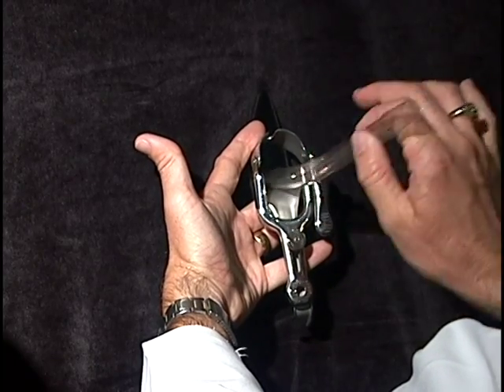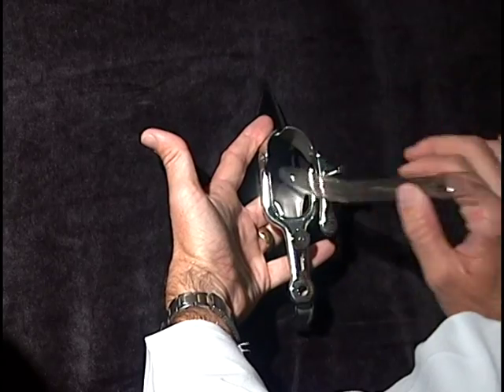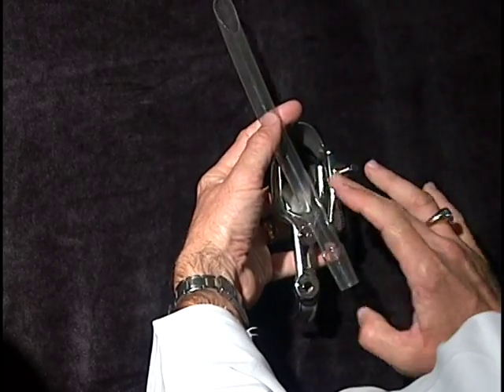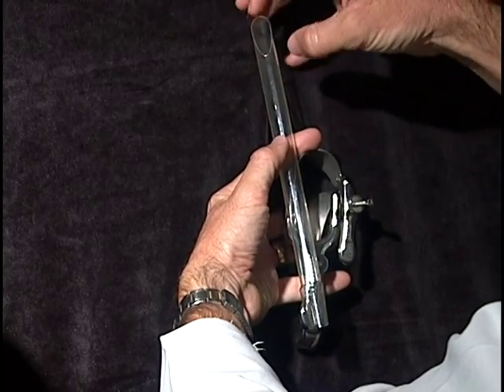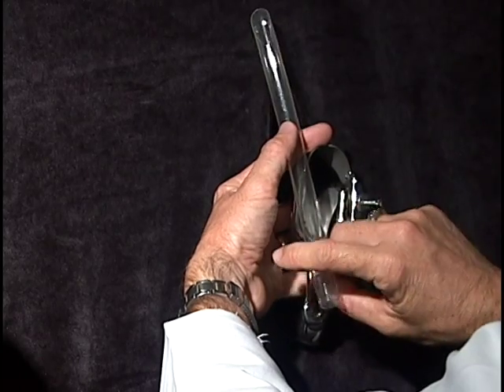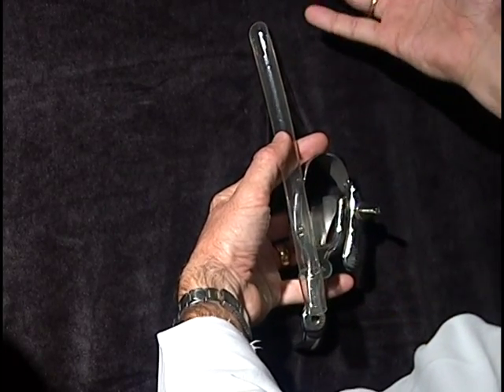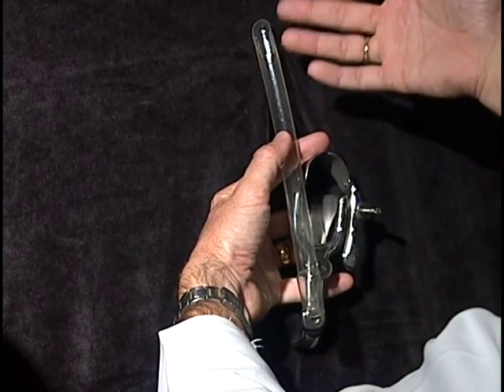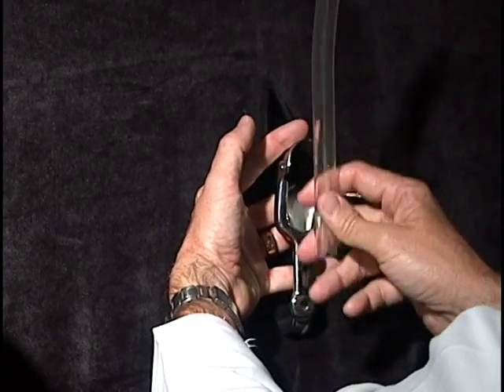The suction curette is placed through the speculum, up through the cervix, and up on the inside of the womb where the baby is. The opening of the suction curette is positioned where the baby, the fluid, and the placenta are. Once it is up by where the baby is, the suction is turned on and the baby, the placenta, and everything else are brought down through the tubing into the suction machine.